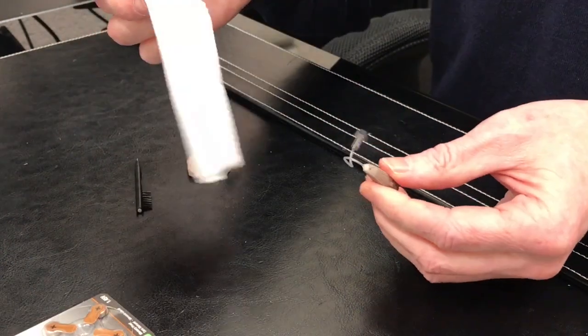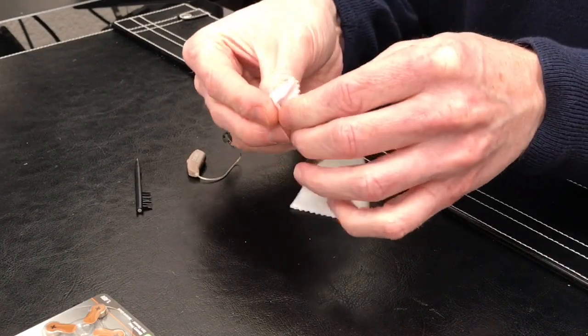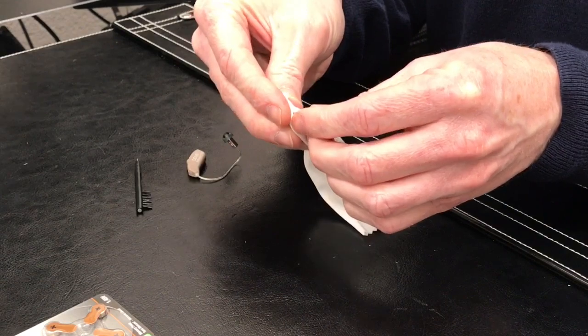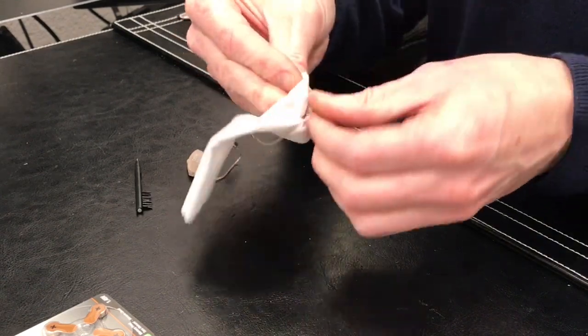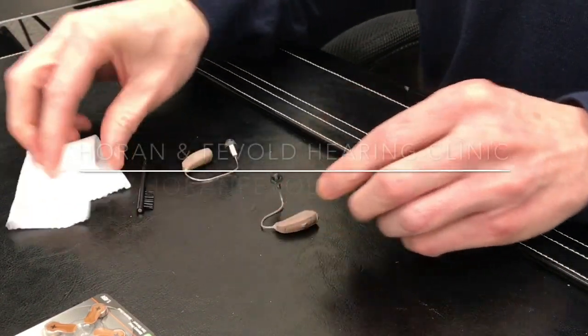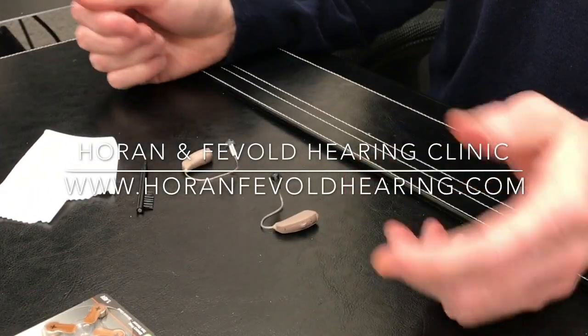You can use that cloth that they give you and just kind of wipe off the body of the hearing aid to get any oils or moisture off that accumulate over the course of a day of usage. And that's the basics of how to clean the hearing aid.